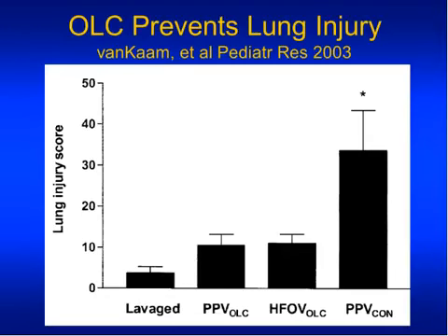I will just point out that older babies, as they develop chronic lung disease, also progressively need larger tidal volume. These are the same babies we started with, less than 800 grams. And as they remain on ventilation, they progressively need a slightly larger tidal volume, even as we allowed CO2 to rise from the mid-40s to the mid-50s. So these are all little caveats that you have to understand in order to apply volume-targeted ventilation optimally.